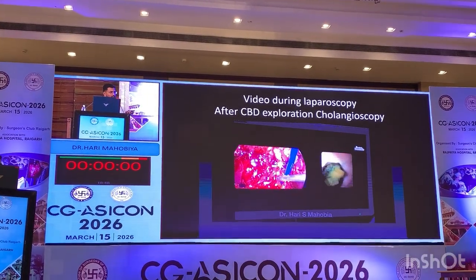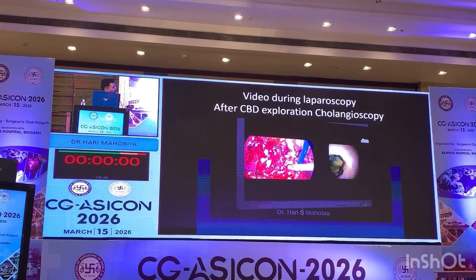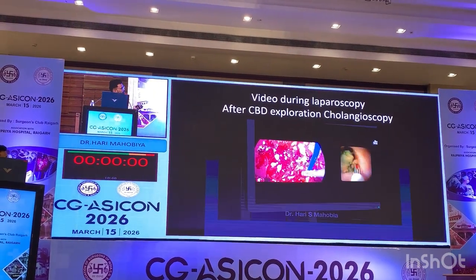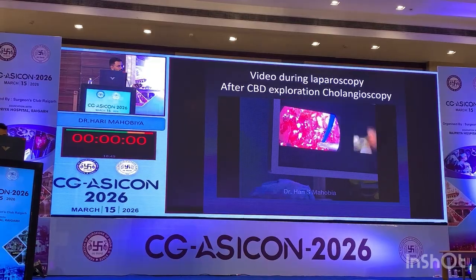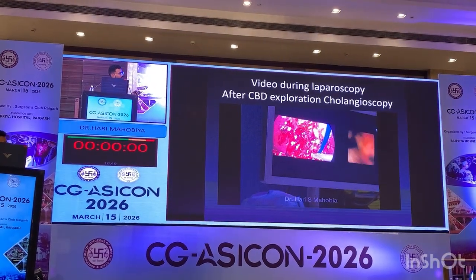This is an ERCP patient who came to us. If it is a soft stone, it can be easily broken using the basket. If it is a hard stone, we use laser lithotripsy.